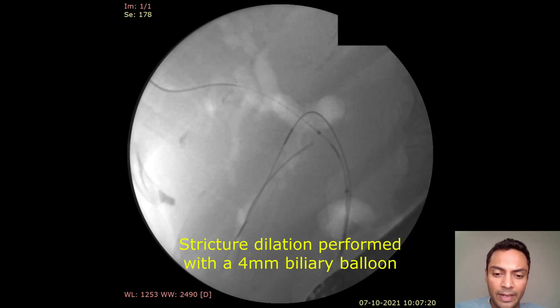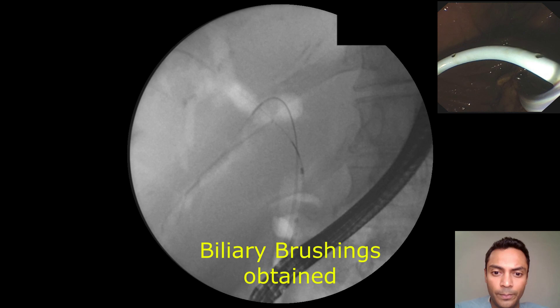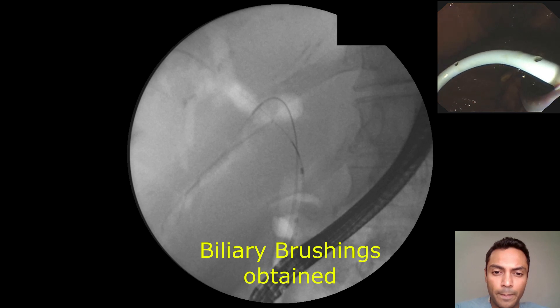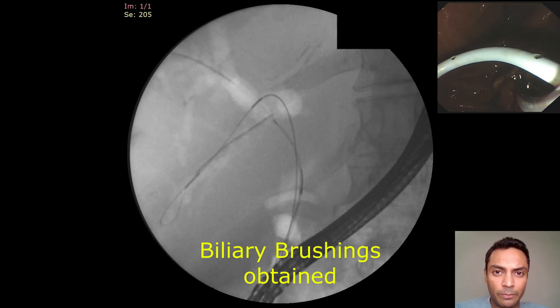Stricture dilation was performed with a 4-millimeter biliary balloon. Biliary brushings were obtained.